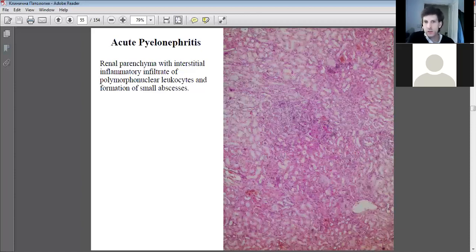If he asks you, is there any normal? Yeah, these tubules are normal because the walls are still intact. The nuclei are still okay. The cells are still intact. The lumens are still normal shape. So it's like spotted in certain areas.